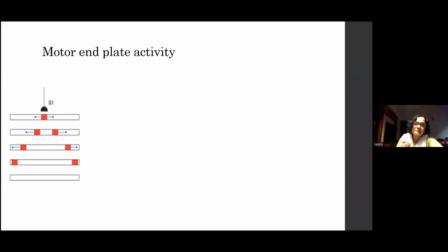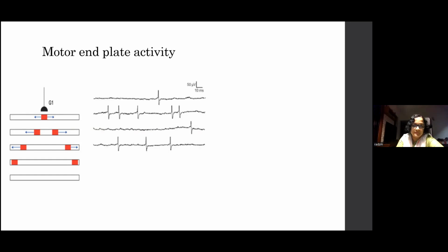So you put the needle in the bulk of the muscle, and you might accidentally be just over the end plate, that's your recording electrode, needle electrode. And then at that point, whatever potentials come up are negative. So in neurophysiology, I think we mentioned that last time, negative is upwards and positive is downwards. So any potential that comes from there upwards is negative, like this.